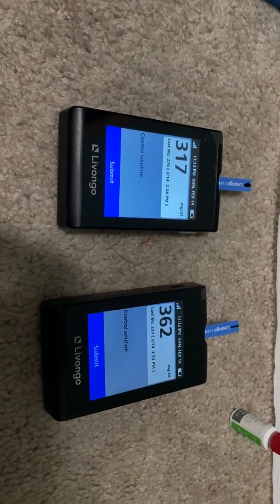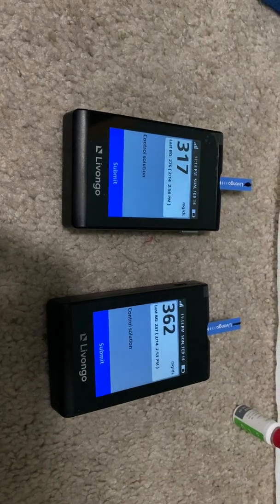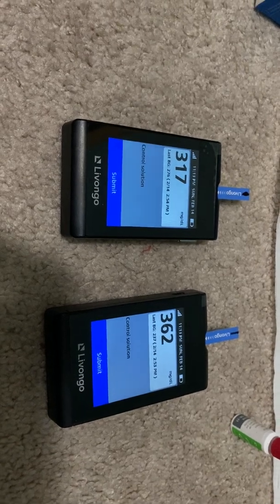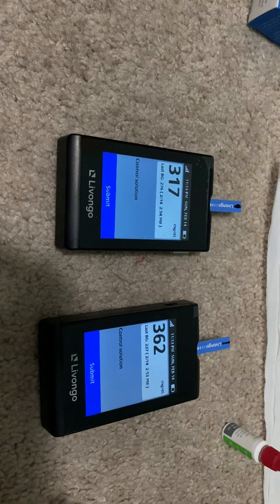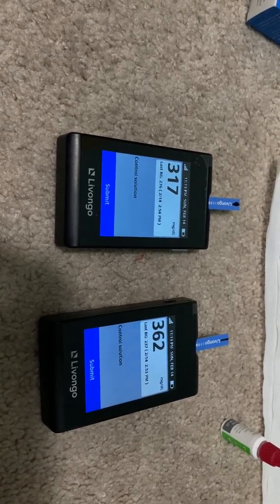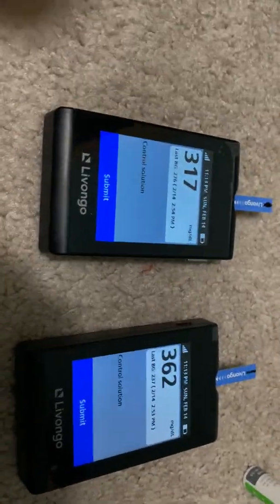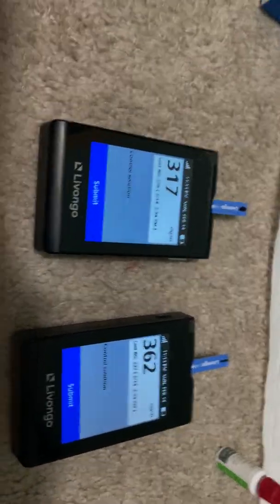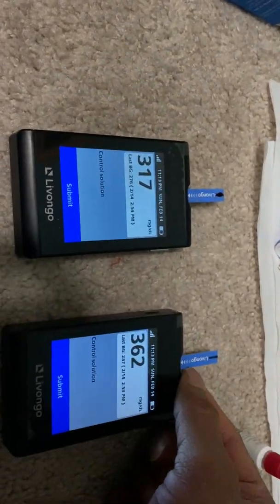For the same solution, same strip, same machines - why is there so much difference? There are a lot of accuracy problems. At a reading around 350, you get a 50-unit difference. So in a reading of 300, you get 50 difference, which means at 100 you'd get about 15 percent error - so plus or minus 15 to 20 percent error. That's a big error - both machines are not showing the same reading.